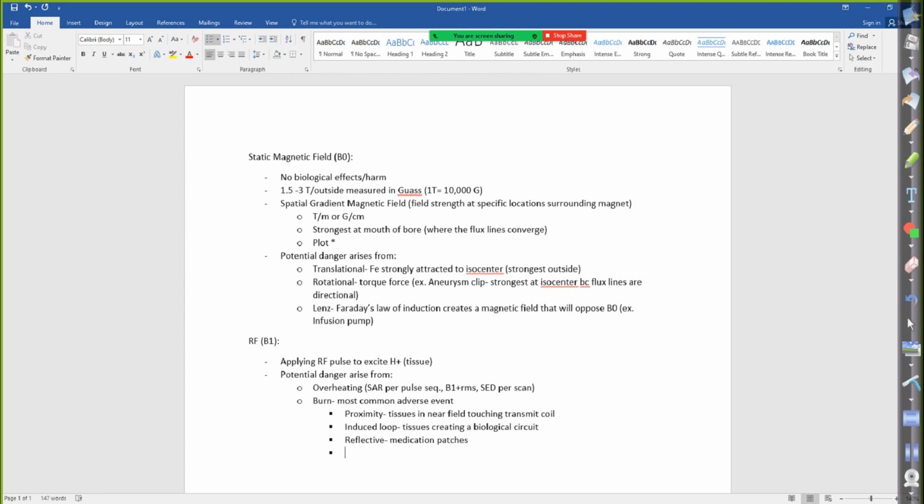And then the last one, it's really dealing with devices. What's that one called? Resonant. Resonant. Or antenna effect, I believe. And that's just devices. So think about size, shape. And when it comes to size, I said any device less than 2 centimeters is not a concern.